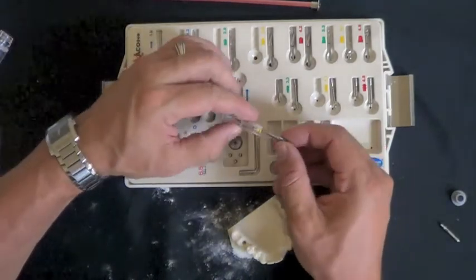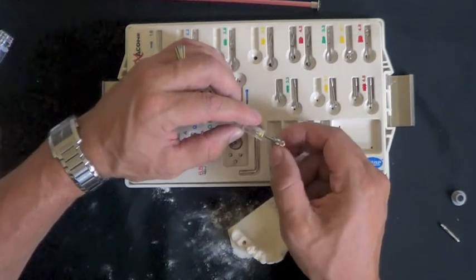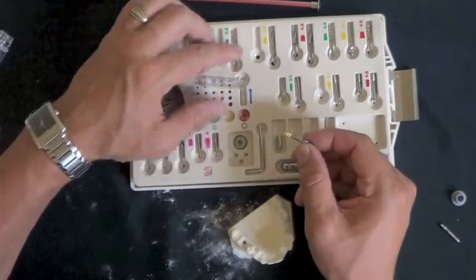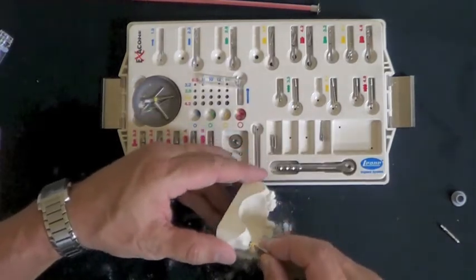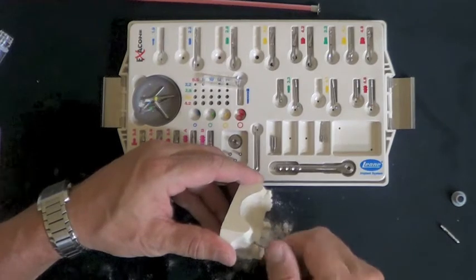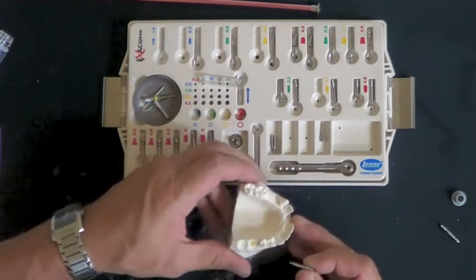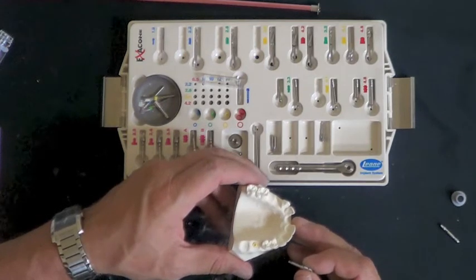It's threaded on the end. Simply rotate this in a couple turns. Pull the cover cap off of the carrier. Insert it into the implant site just by pushing it down. Rotate it counterclockwise. And now you have your cover cap placed on the implant.